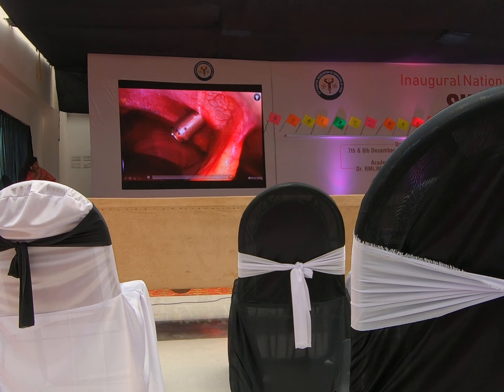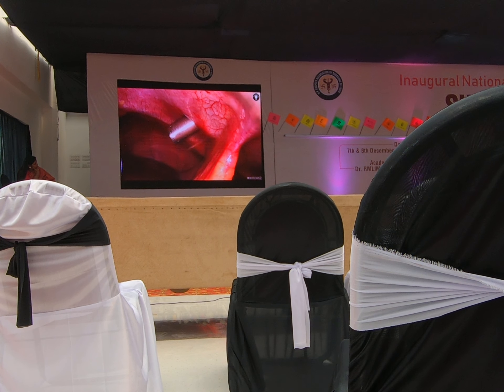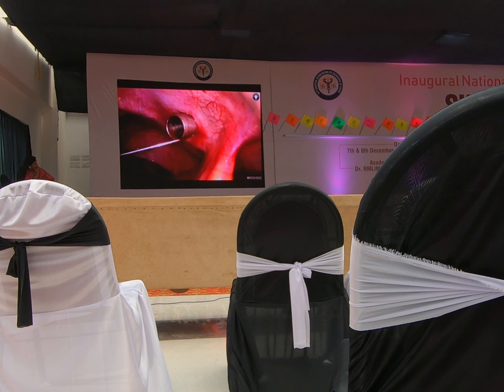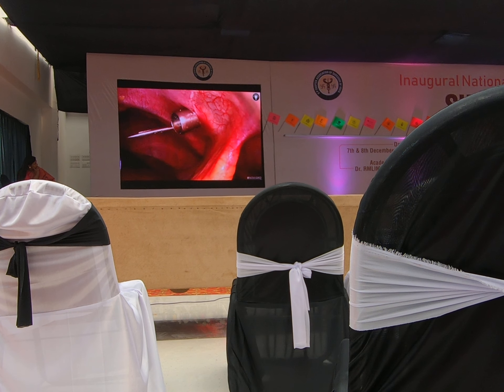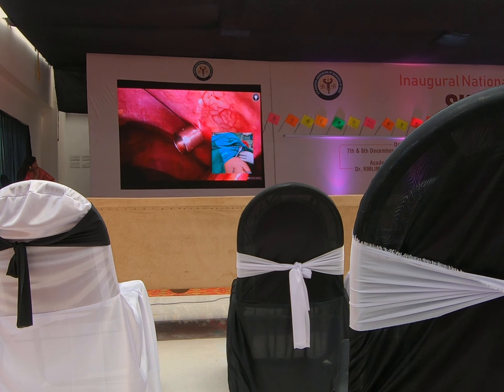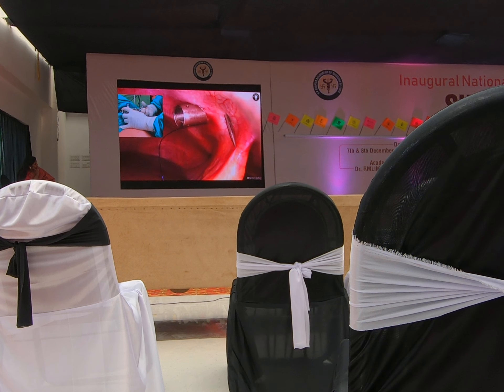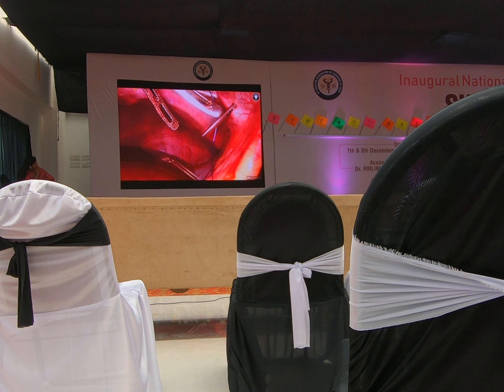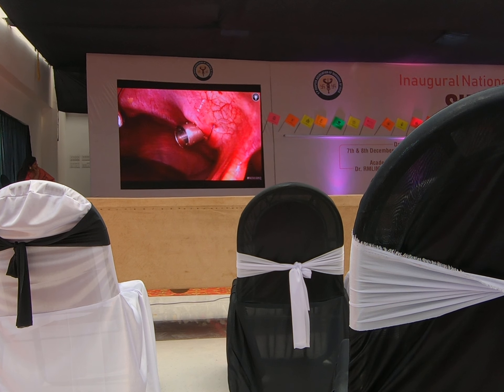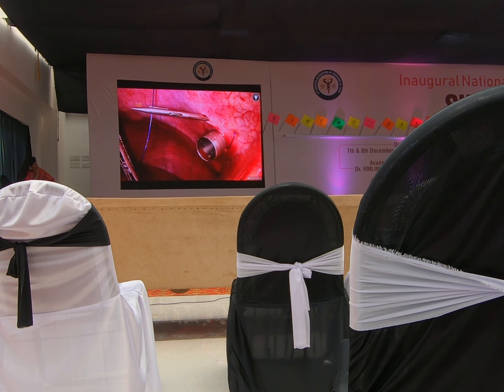Here is the epigastric port at the end of the procedure. We take a routinely available cobbler needle as a suture passer and pass it at an angle to the port, introducing it inside. A 20-centimeter length of polydioxanone delayed-absorbable suture is then brought out, and this end of the suture is attached to a hemostat. You angulate your cobbler needle in the opposite direction, reintroduce it, and you have a good bite on the abdominal wall. It adds maybe 40 to 50 seconds to your entire procedure.